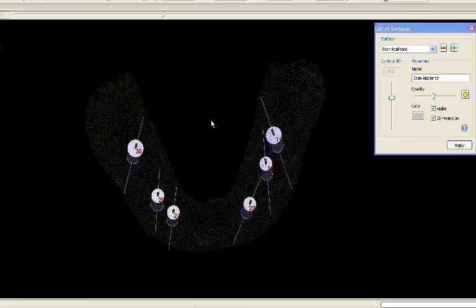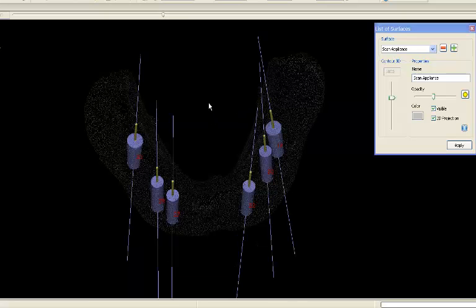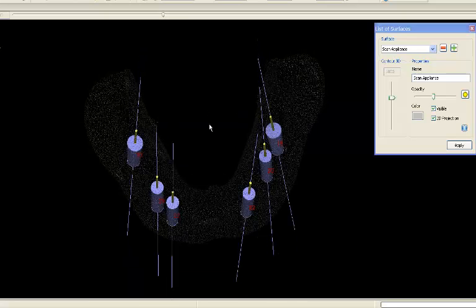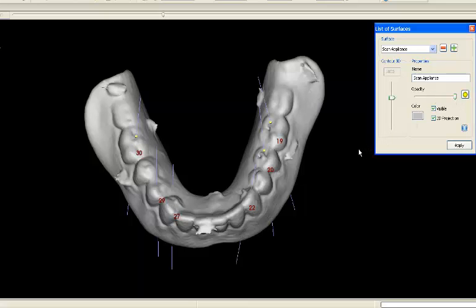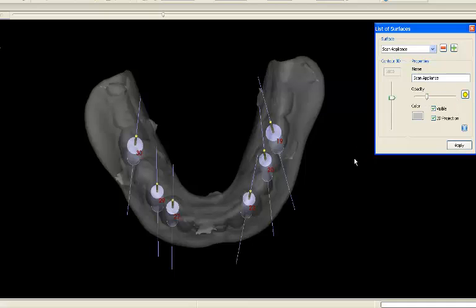We use dentures as well. This is a case where a fixed prosthesis will be made and the denture is used to determine future tooth position.